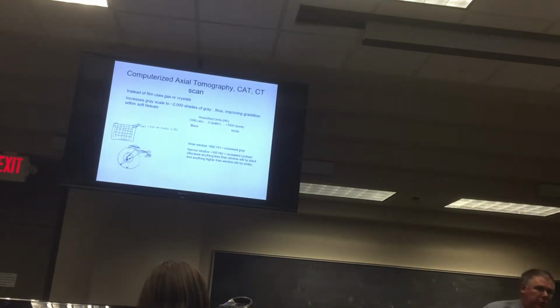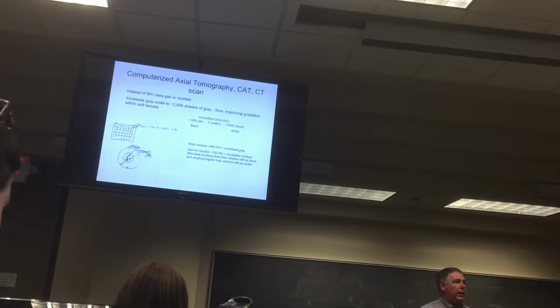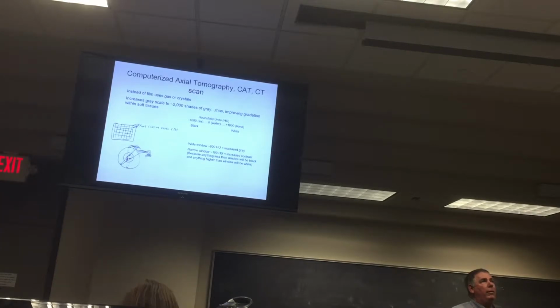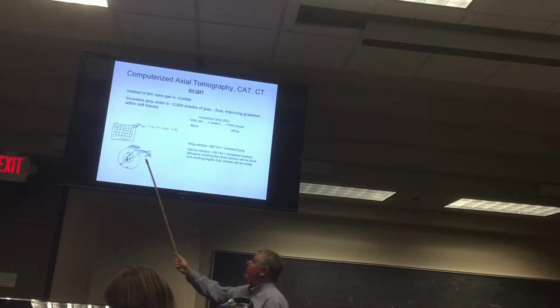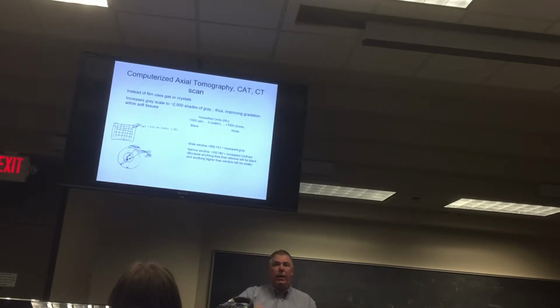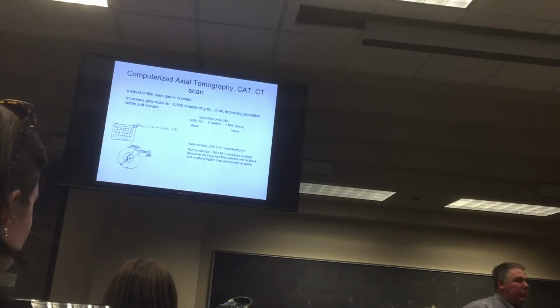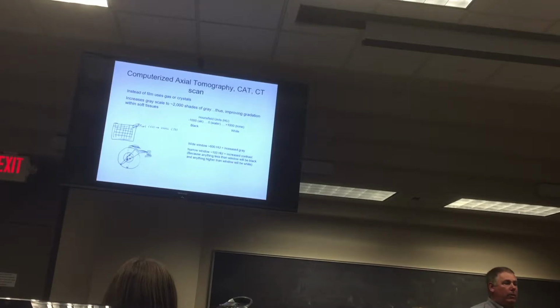Okay, let's use ionizing radiation a different way and talk about CTs, CAT scan, computerized tomography, whatever you want to call it. Here you always have a cylinder, and you have a detector much like a digital X-ray. The cathode revolves around that circle, taking X-rays at different points. So instead of being exposed to 1 shot, you're exposed to 50 shots, and that's why there's so much higher a radiation dose.